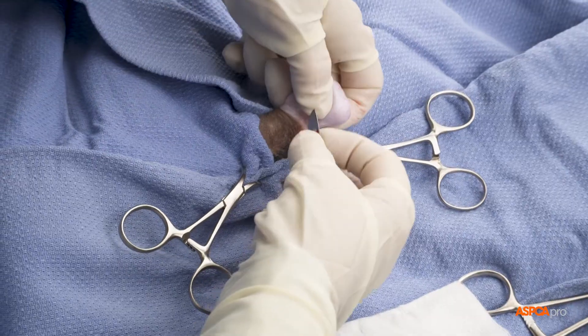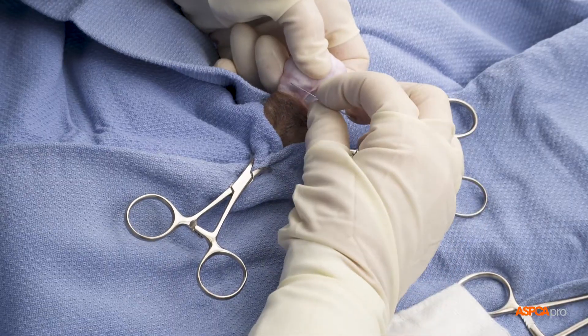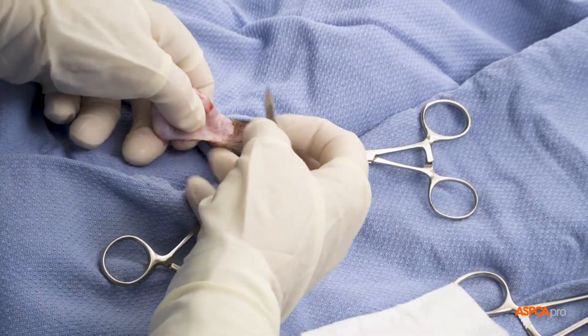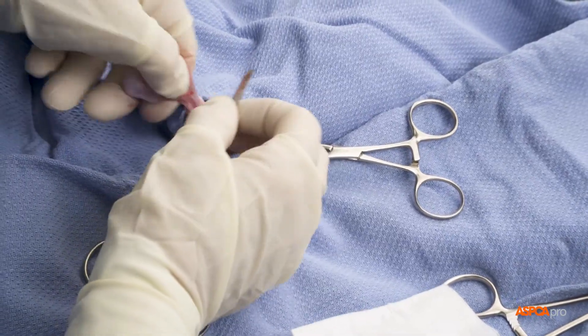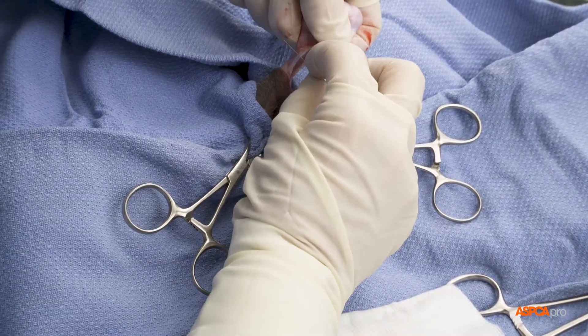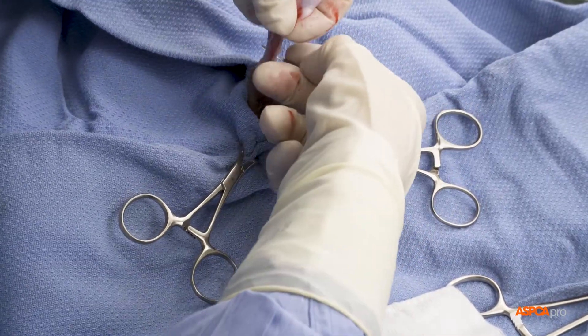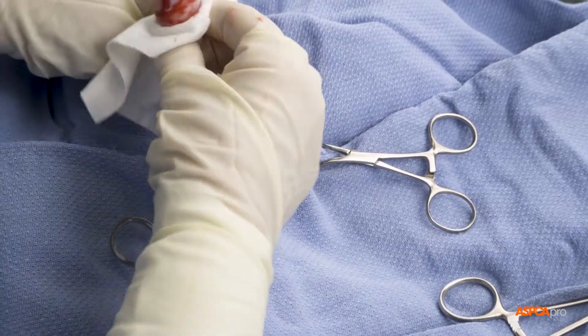One testicle is then pushed out through the opening and held in one hand, while the surgeon removes fat and tissue from the attached spermatic cord, often using a surgical blade. This cord is a bundle of nerves, blood vessels, and ducts. Gauze can also be used to strip the tissue manually.